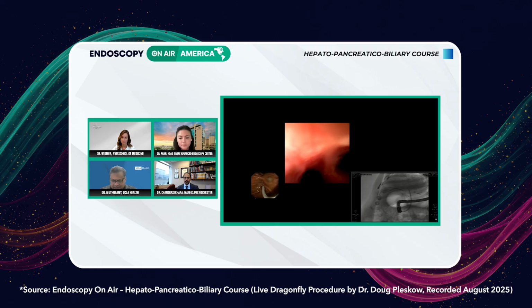And you can see here on the right-hand side, I have what looks like a little bit of an ulceration. And I'm just slowly trying to manipulate that up. You can see the images are really very nice here, but there is an ulcer right here. There's a little bit of mass effect as well. So it doesn't look like it's a stone. I'm going to just try and keep going up. Now it could be a stone behind that as well.